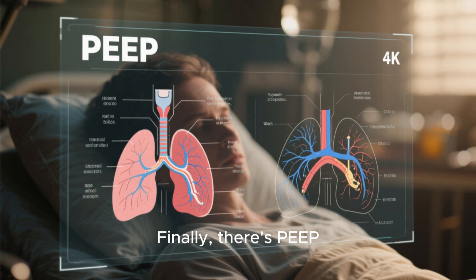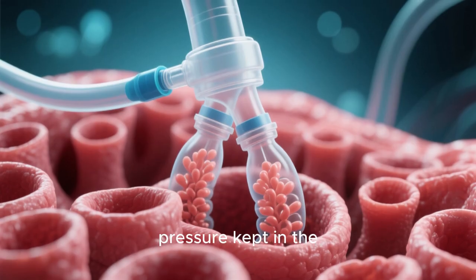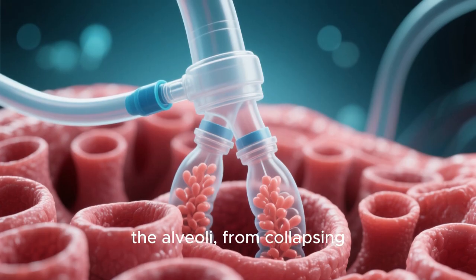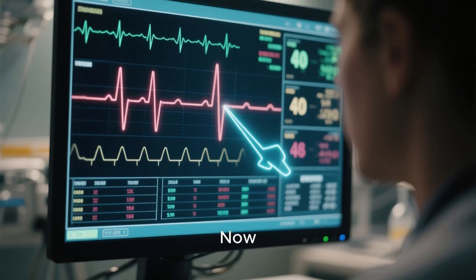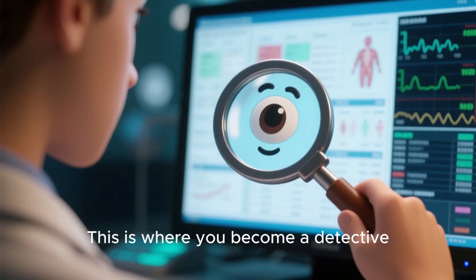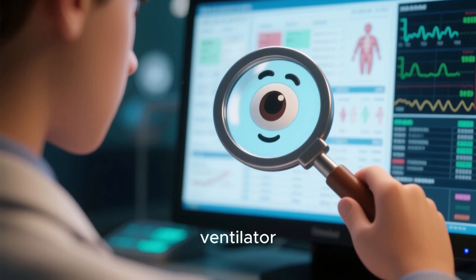Finally, there's PEEP, or positive end expiratory pressure. This is the small amount of pressure kept in the lungs at the end of exhalation to keep the tiny air sacs, the alveoli, from collapsing. PEEP helps improve oxygenation. Now, once the patient is on the ventilator, your job shifts to monitoring. This is where you become a detective. You need to constantly assess your patient and the ventilator.